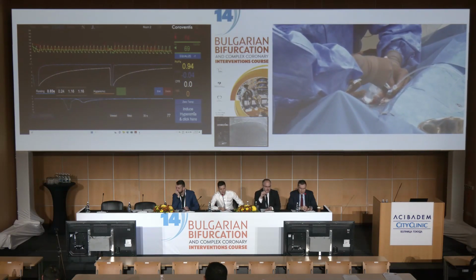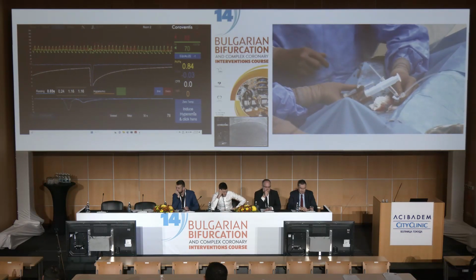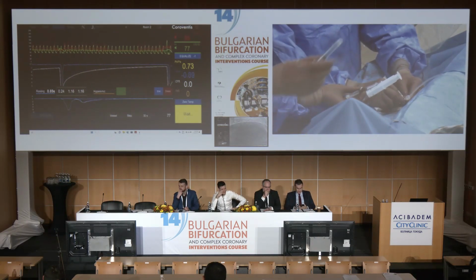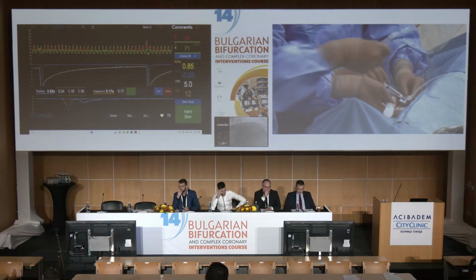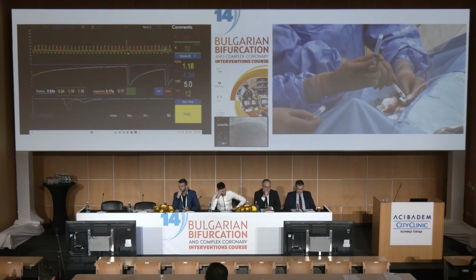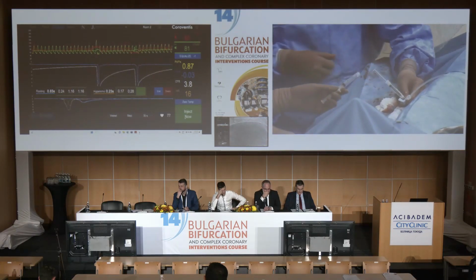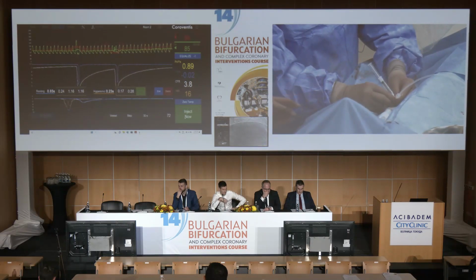Maybe you should repeat. Wait a minute. Should click again. Okay, we have plenty of time. We have induced hyperemia, so click here. Inject now, you can go. We are still hyperemic, there is no rush. Inject now, again, you can do it. And then we are waiting for the third time. When we will be done with the third time, we will have the average. Okay. Inject. I already see that we made a small mistake, but okay, that's not a problem.